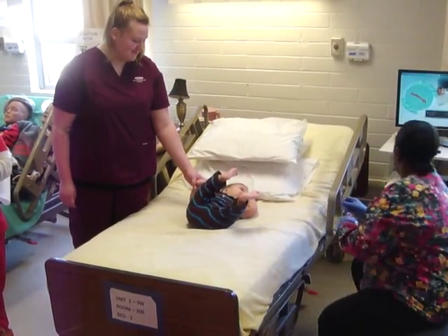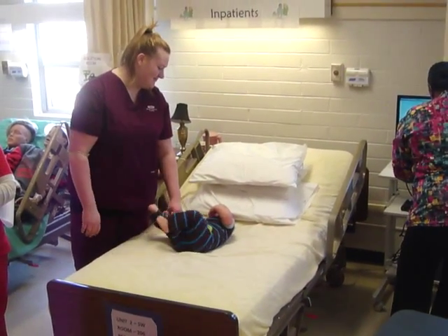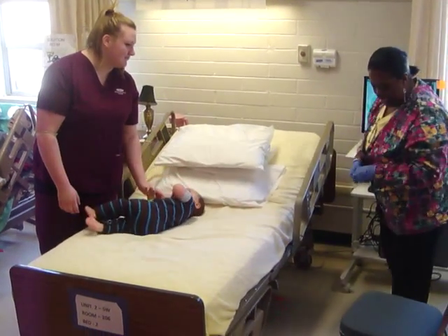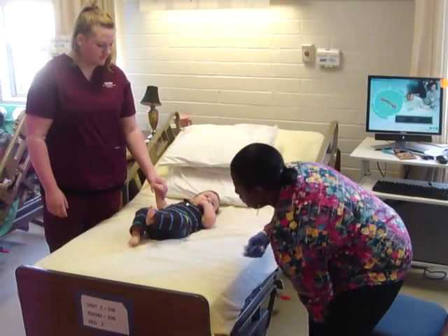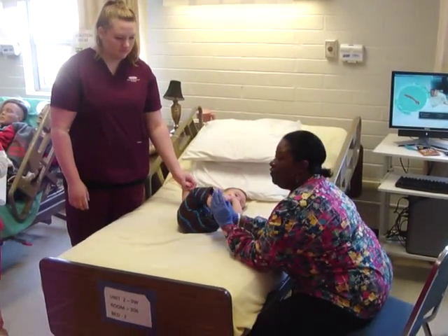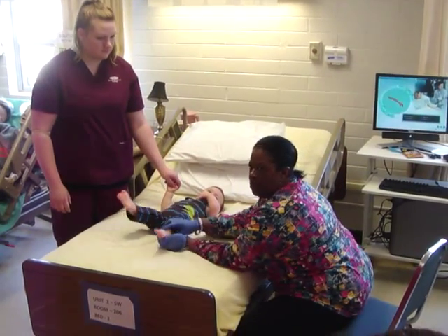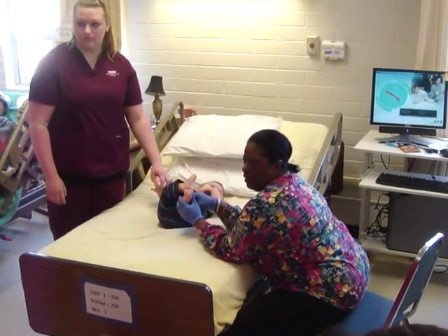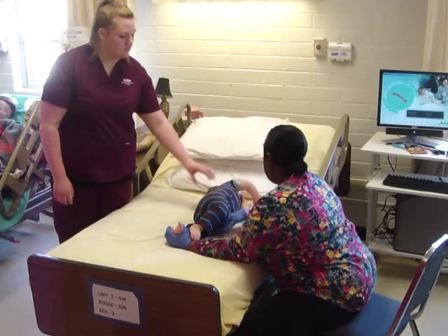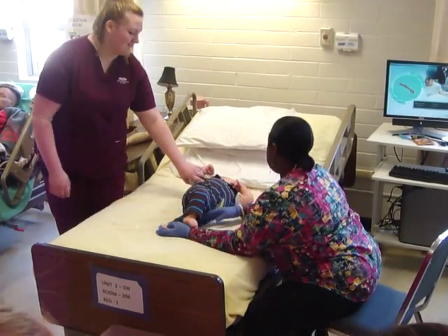It's mandatory: if we draw infants from the feet, from the heel, we have to warm that site up for five minutes. You warm that site for five minutes before you do the draw. And common-sensically, why do you think we're doing that? To raise the blood up to the surface, making it easier to do the blood draw.